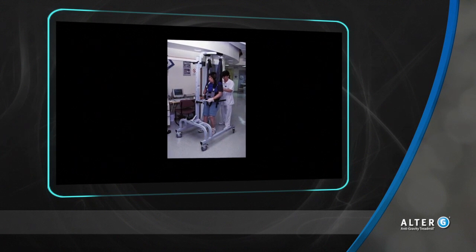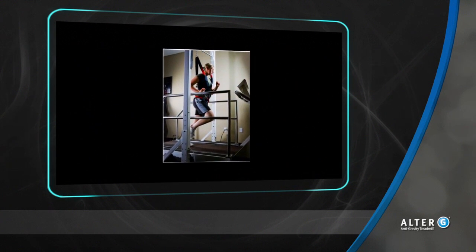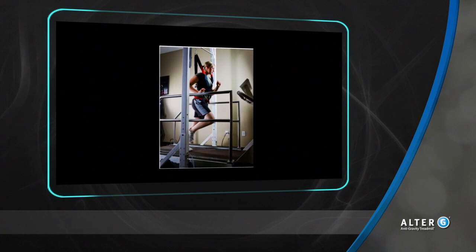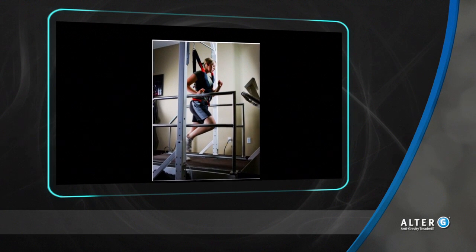Body weight support is a great tool for decreasing pain, protecting healing tissue, and encouraging normal mechanics for the user. In addition to walking, the user can perform any closed kinetic chain activities at partial body weight.